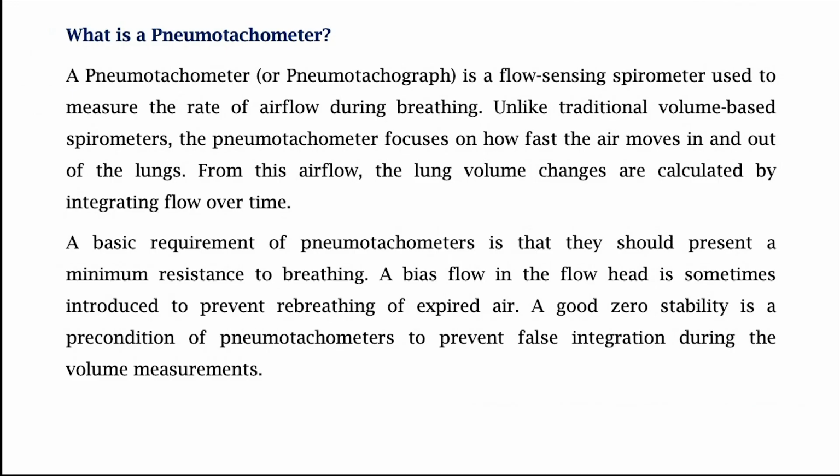But if the resistance that you're using to make the measurement is too much, then essentially flow will be stopped. The method that you're using to make the measurement should not affect the measured quantity itself, the fundamental rule of measurement. So a critical trick is to make sure that there is minimum resistance so that you can make the measurement, but not too much resistance that it stops the flow, or otherwise provides an obstruction to the flow. That's the critical point, and that's what many of us find difficult to understand or imbibe.